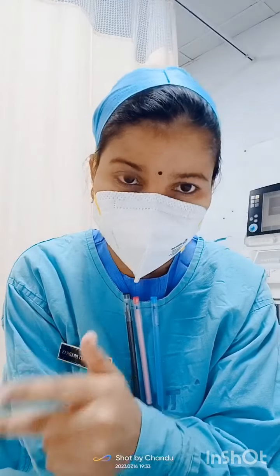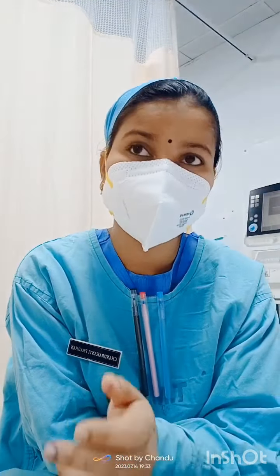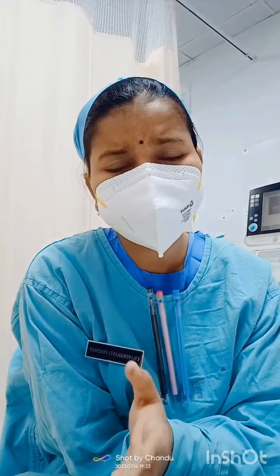Next comes the types of defibrillator. There are mainly three types. The first is the monophasic defibrillator, which provides 360 joule energy. The second is the biphasic defibrillator, which provides 120 to 200 joule energy. The third is the automatic external defibrillator. In an automatic external defibrillator there is no need for any medical knowledge to use it. You only have to apply the paddles and the machine will recognize the rhythm and then give a shock to the patient.